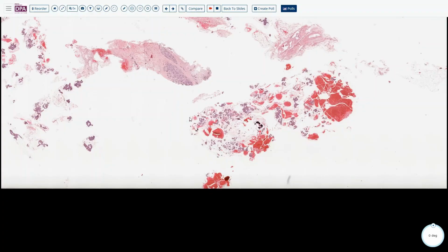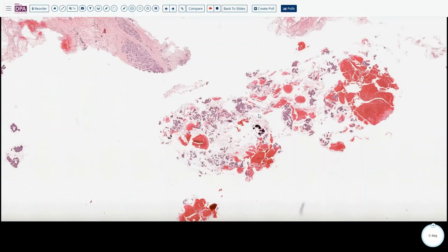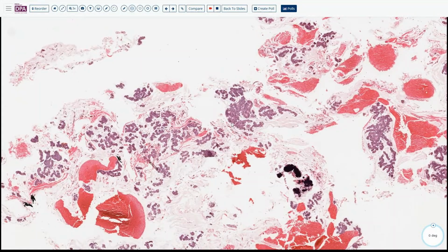You have to sign out ductal carcinoma with mucinous features, because for a true mucinous carcinoma we think of a really good prognosis for the patient, so you could not definitively call it mucinous carcinoma in this core biopsy. This is one educational point from this core biopsy.